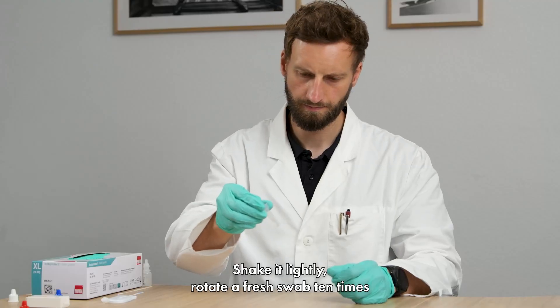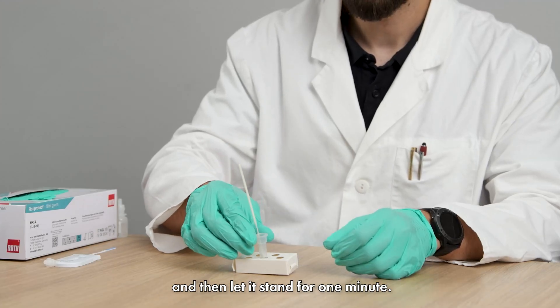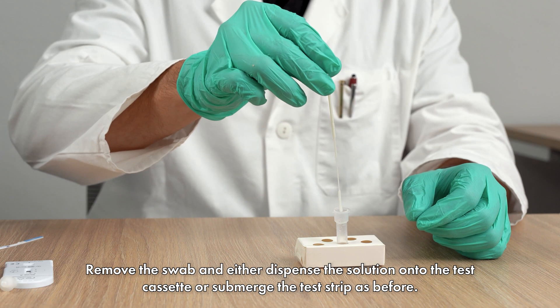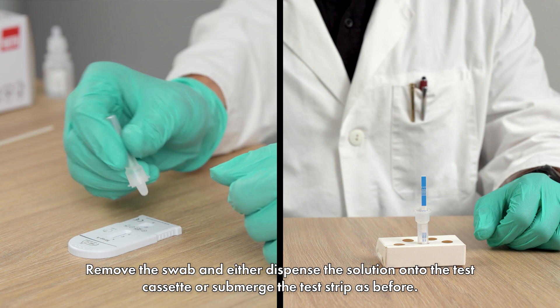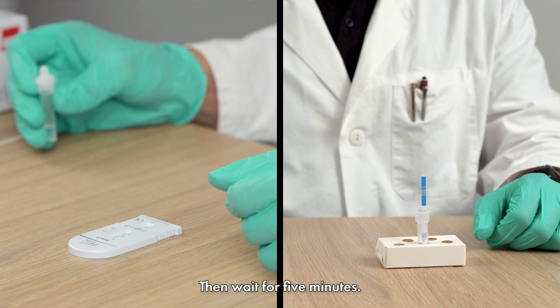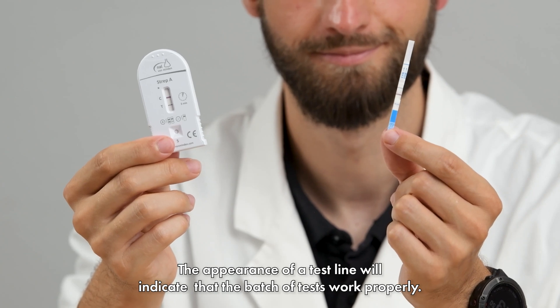But this time also add 1 drop of the positive control. Shake it lightly, rotate a fresh swab 10 times and then let it stand for 1 minute. Remove the swab and either dispense the solution onto the test cassette or submerge the test strip as before. Then wait 5 minutes. The appearance of a test line will indicate that the batch of tests work properly.